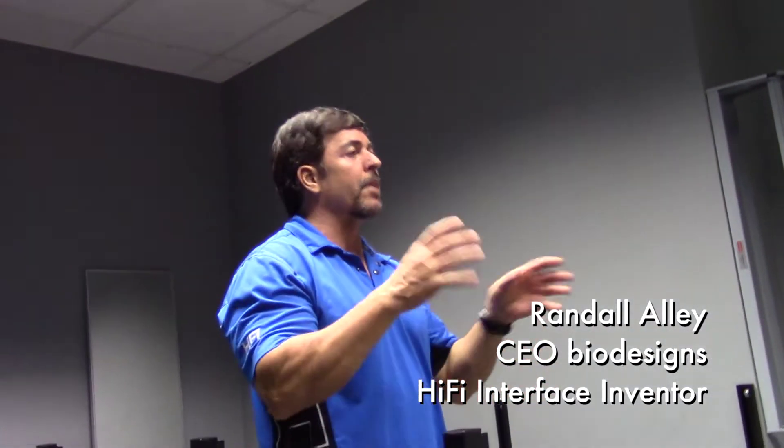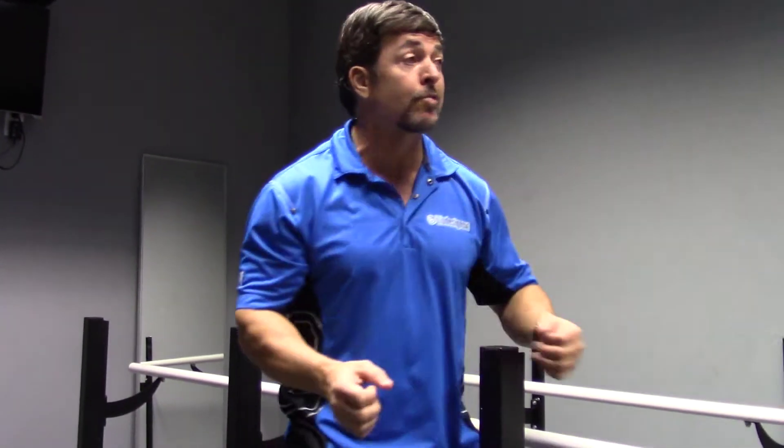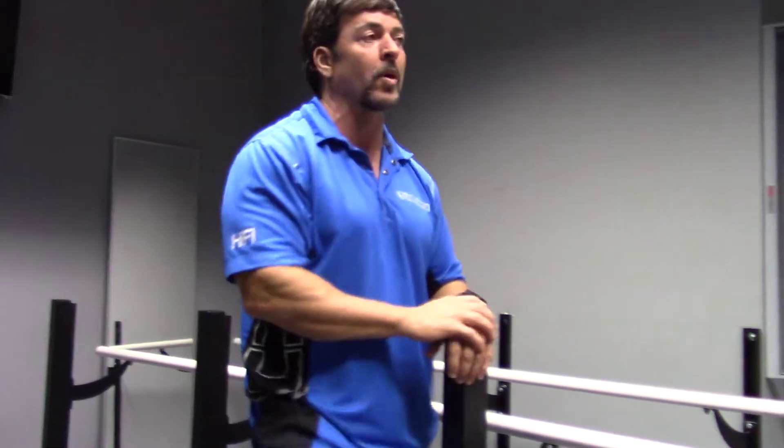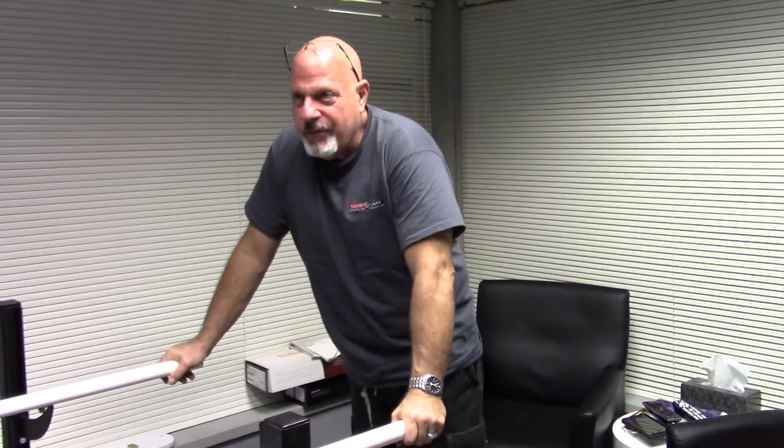I knew it would be slightly better, but the biggest thing that came out was: when I changed directions really fast, it's locked on. When I play basketball and I'm turning, I'm not thinking about 'am I going to slide out?' Because it can't — a normal socket is made to do that, it's made to hold on.